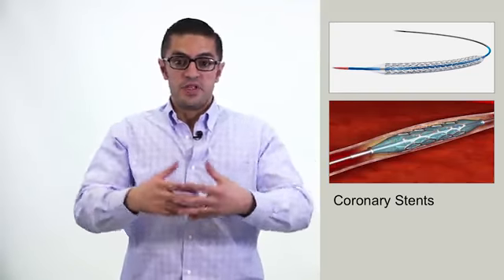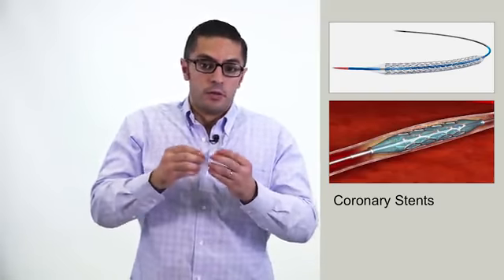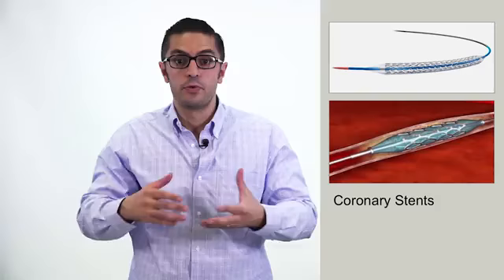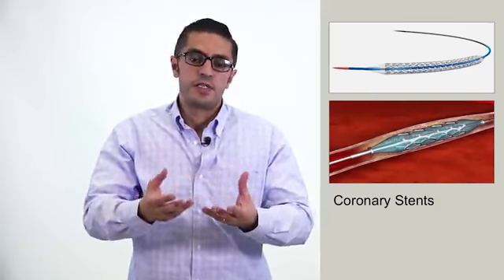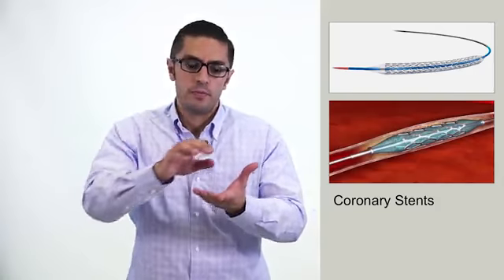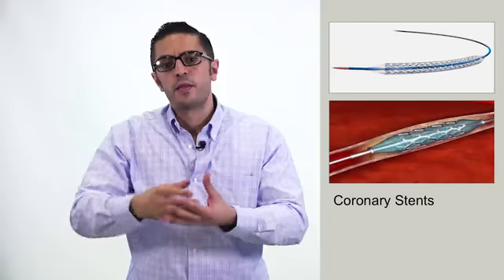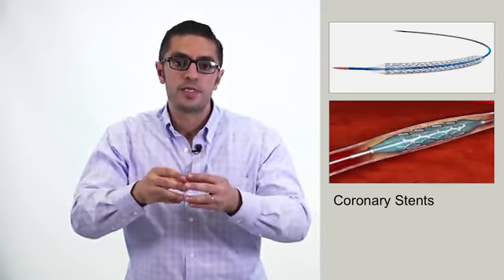We have this new material, this stent. It could just improve the outcomes in such patients. And so we thought, why won't we make it better? So the first stent was a bare metal stent made up of stainless steel. Let's improve this metal. So we put cobalt chromium, and we used cobalt chromium instead.